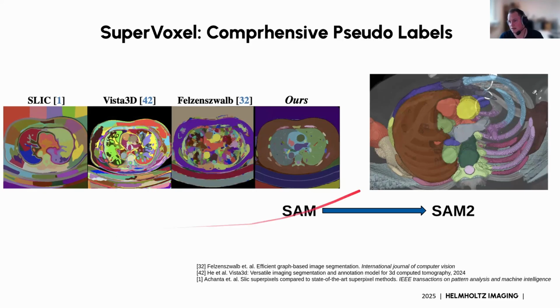And as you're seeing here with the ribs, the segmentations aren't perfect, and this is fine. This is intentional, because by using these imperfect segmentations we are essentially contradicting other labels that we have in our data set, so that we force the network to figure out what it is that the user wants, rather than just relying on predefined concepts like the rib classes we already have in the training data set.